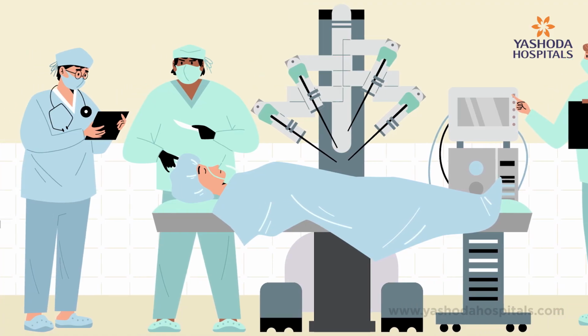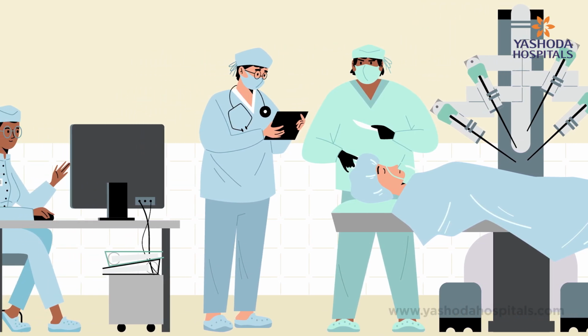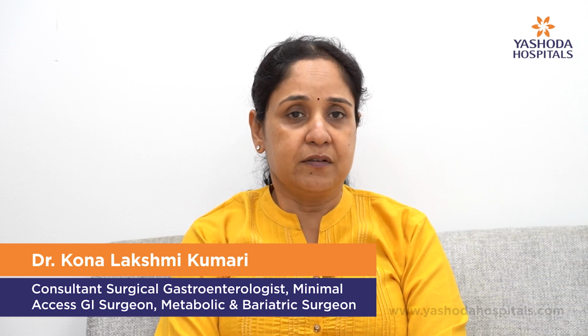But here there's a lot of strain on the surgeons while doing this complex procedure, because they stand for long hours during the procedure, and because the camera is held by a co-surgeon, sometimes the camera movement can cause a lot of fatigue to the surgeon. And the finer surgical parts where they need slightly more intricate movements can sometimes be a little difficult for some of the surgeons. So to overcome these problems and to have a very smooth surgery, making the most difficult surgery also reasonably simple without much fatigue to the surgeon, the robo comes into place.